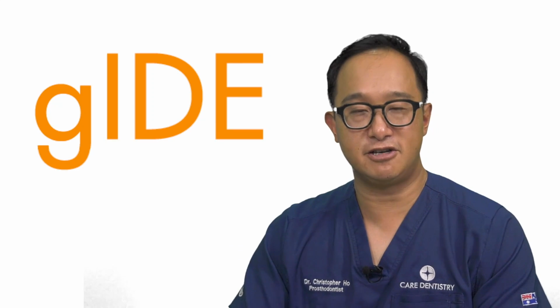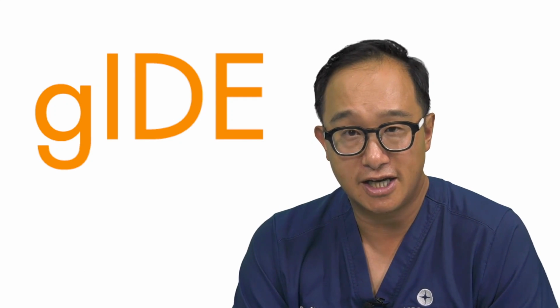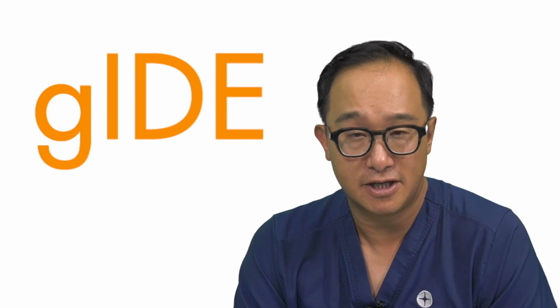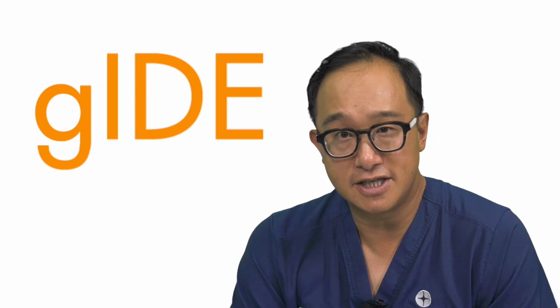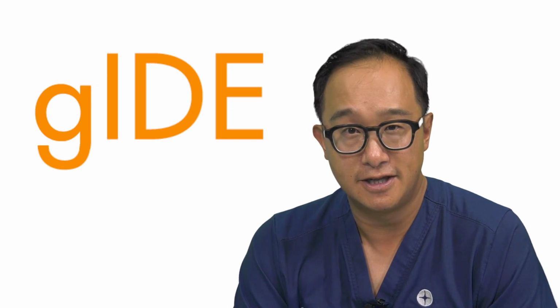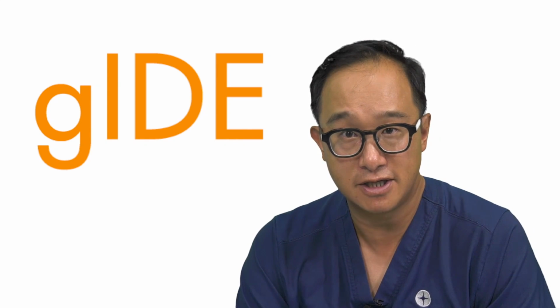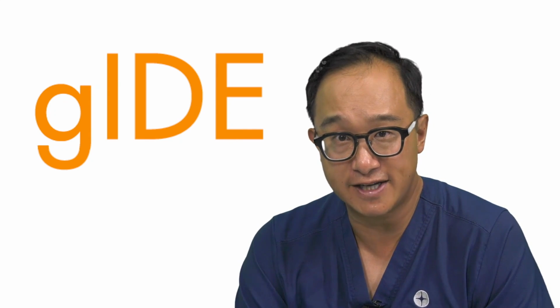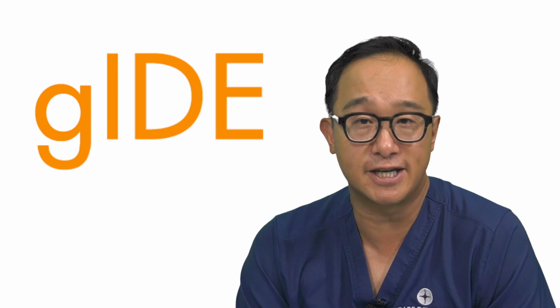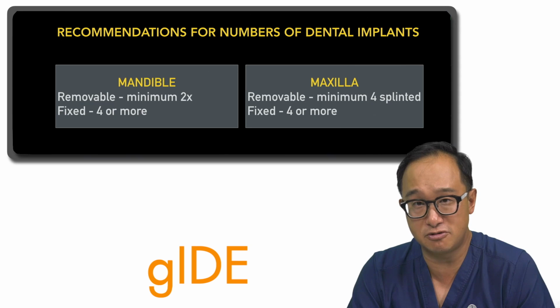Now, we hear about the all-on-4 approach, and the all-on-4 approach is certainly an excellent treatment protocol. But what I don't like about this is that oftentimes dentists think of it like a cookbook recipe. They apply that same recipe for every single patient, and every patient is individual. Every patient has other risk factors, and they have other complicating factors such as parafunction. You need to decide when it is suitable to use an all-on-4 approach, or maybe it's 5 or 6 implants that you'll need to use.